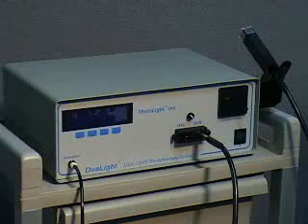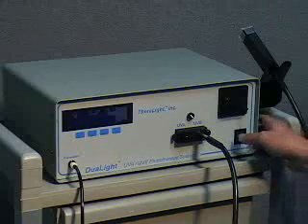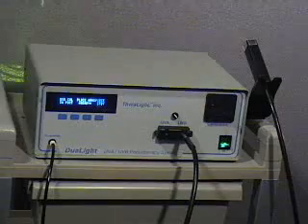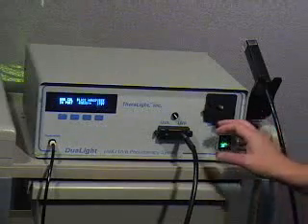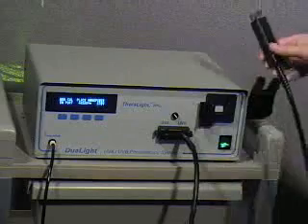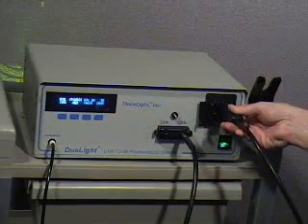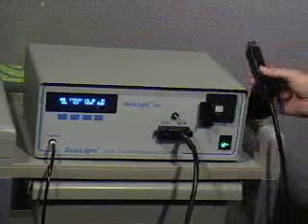After turning the power on and completing a 2-minute warm-up period, the system is ready for calibration. Calibration is simple to perform. The process involves placing the handpiece in the system calibration port and stepping on the foot switch. After several seconds, the calibration process is completed.